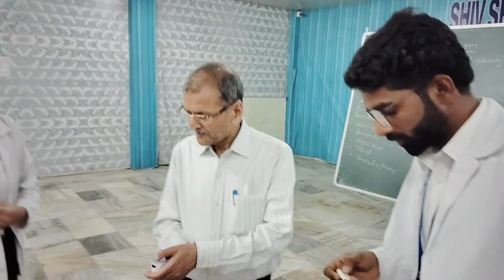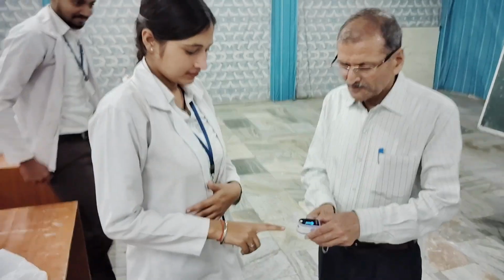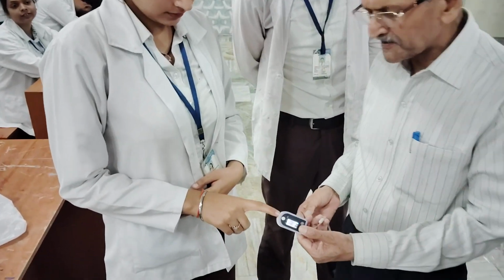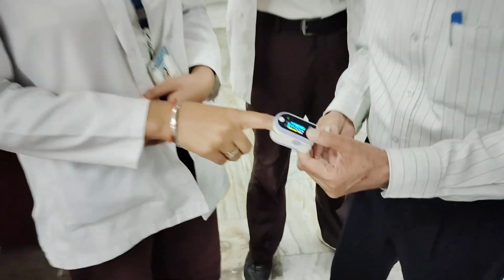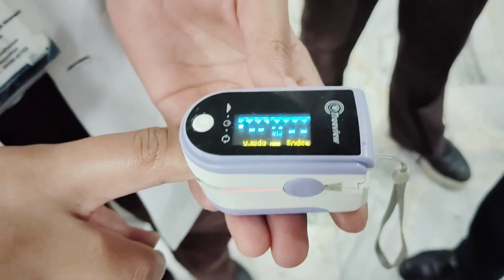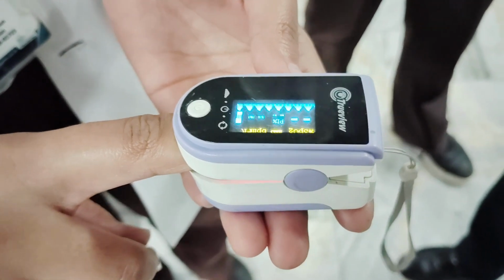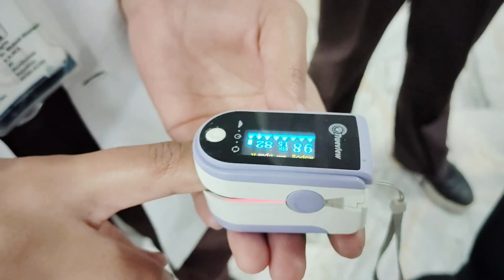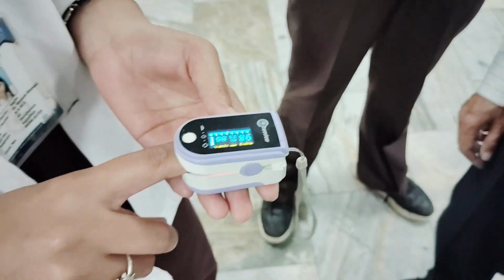Anyone else? Any volunteer who wants to come? Come here. So you make it on from here and press it, and this is like a clip and you hold it. So it is 98% and the heart rate is 82. This is also normal, right?